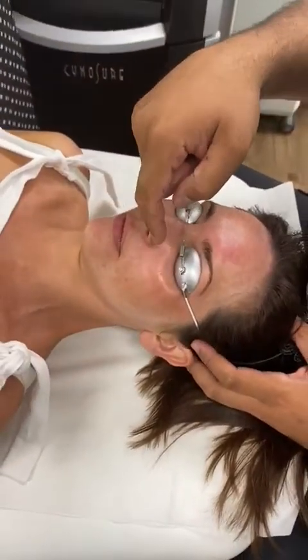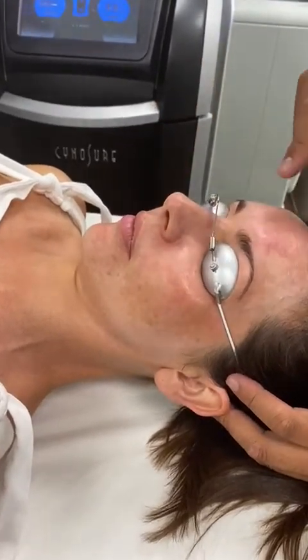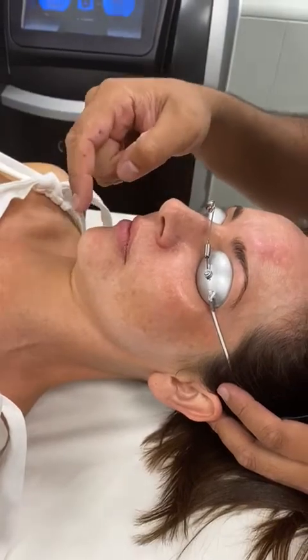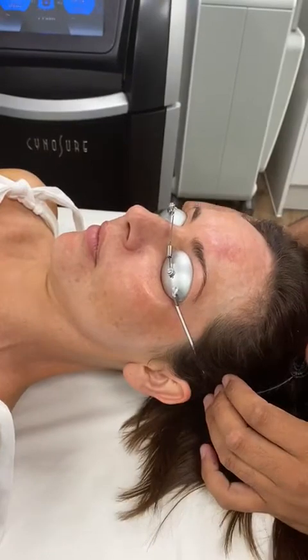She has quite a vascular melasma as well, because she has quite a lot of vessels that are visible, that correlate with the darker area of pigmentation. It's quite typical, symmetrical, mask-like pigmentation.